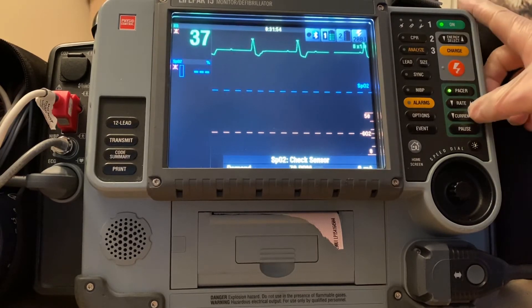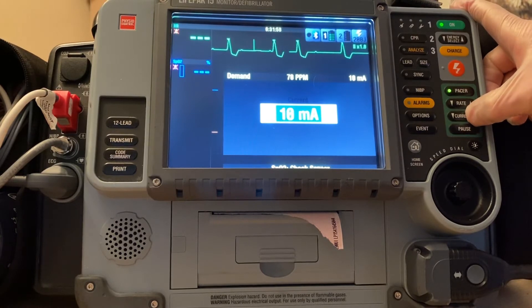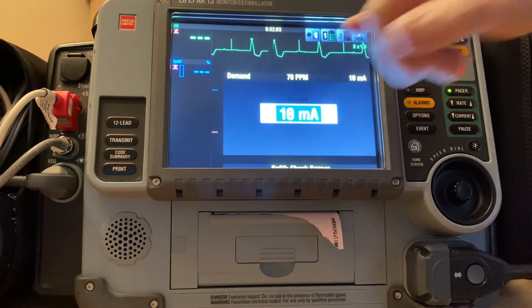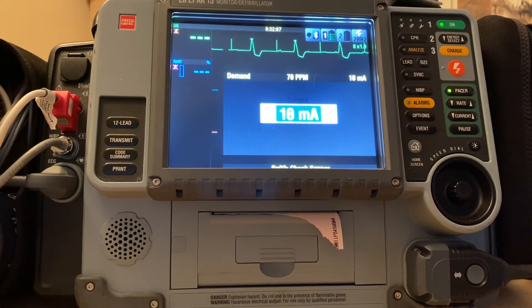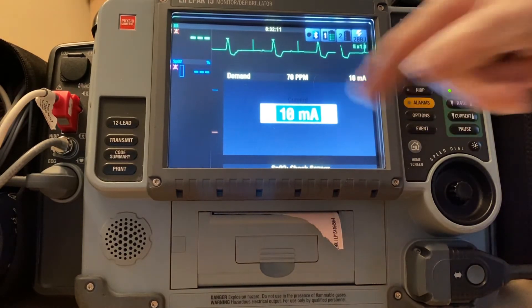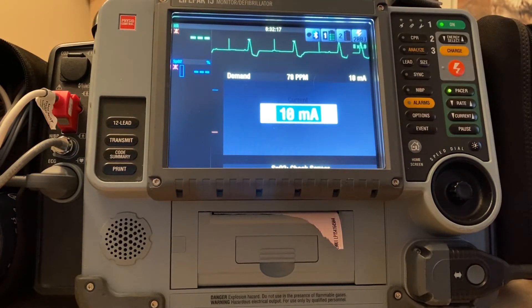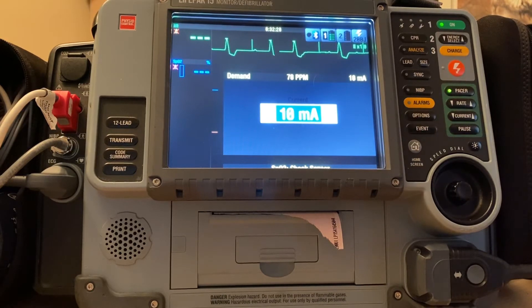I'm going to start increasing the current here. You can see what has started to appear now — what we call pacer spikes. This is an indication that the machine is now delivering energy through the pads into our patient. Of course, it's very low now; the patient may feel it, but at this low level it's obviously not going to cause an electrical or mechanical response.